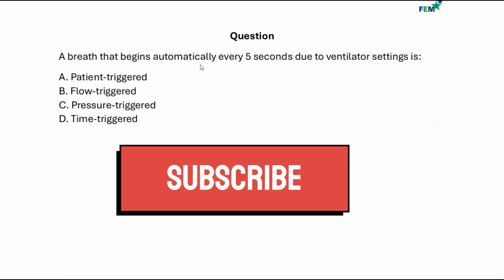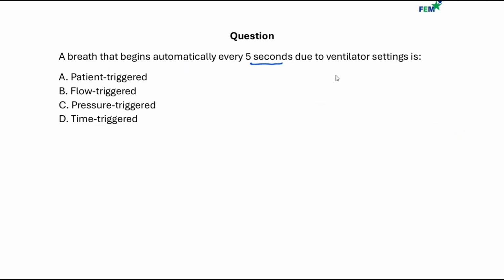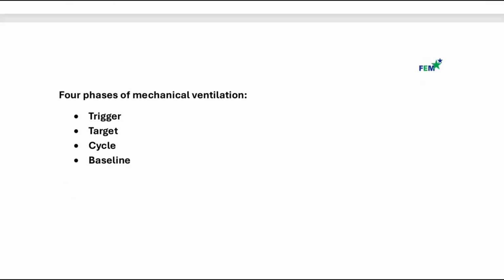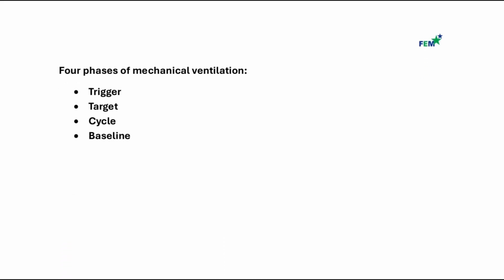A breath that begins automatically every 5 seconds due to ventilator settings is, because we set the time, going to be time triggered. So let's see why.